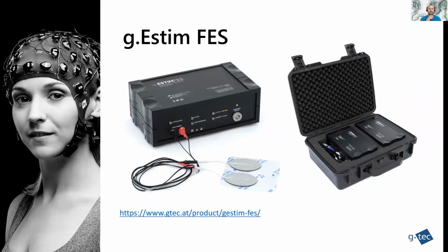So for the FES stimulation, we use the eStim FES. This morning you saw the eStim Pro already. From the outside, you cannot really see a big difference because they look exactly the same, only the label is a little bit different. From the inside, it's a little bit different because the currents that we are using for the stimulation are different. And also from the handling point of view, of course.